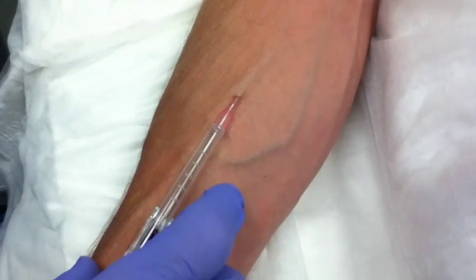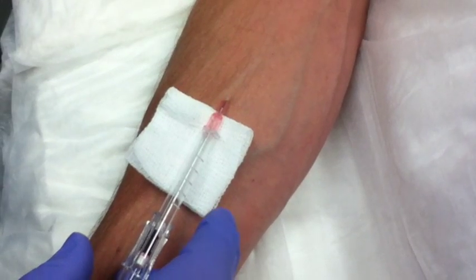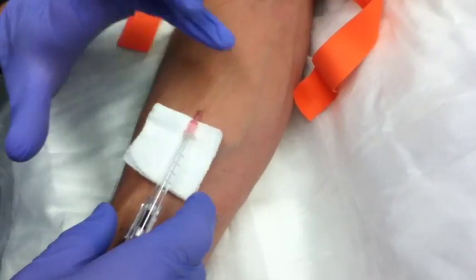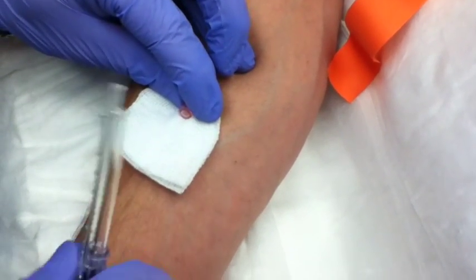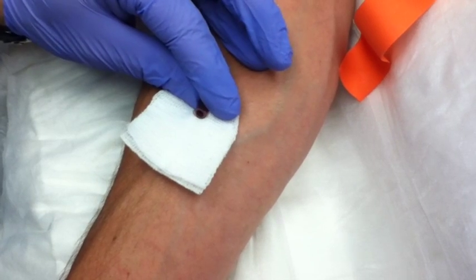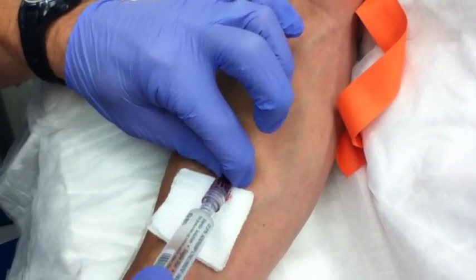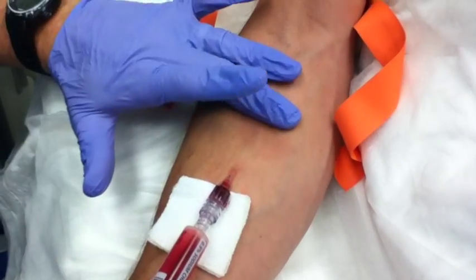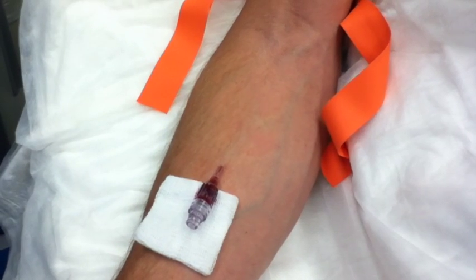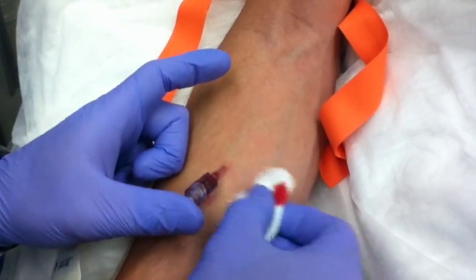I'll bring the needle all the way back. At this point I can easily do a blood draw — I'll take a vacutainer and draw the blood. I can release the tourniquet; we don't want to keep it on for more than a couple of minutes. Distal pressure to the catheter as the needle comes off, then insert the saline lock and flush. I can release a little pressure to confirm blood comes all the way down. For this example, I'll use the small saline lock hub — twist that on, always draw back a little to confirm good flow, then flush. That flushes nicely. Take the sharps out of the way and clean around the area so the sticker sticks nicely.